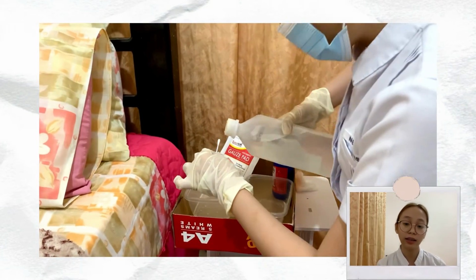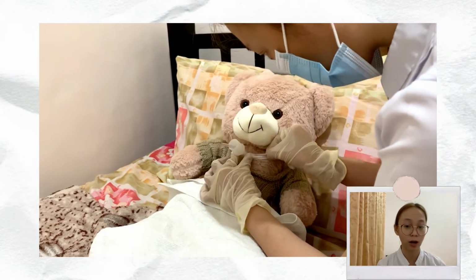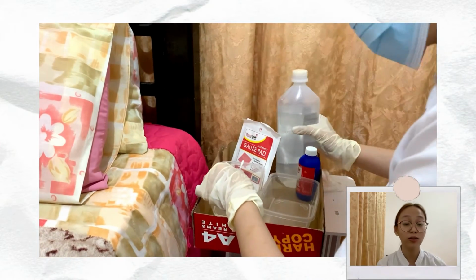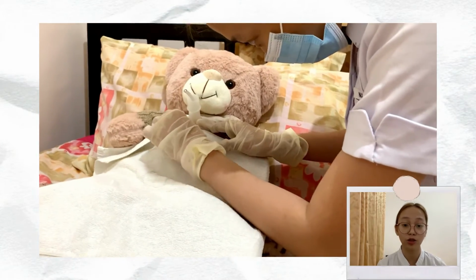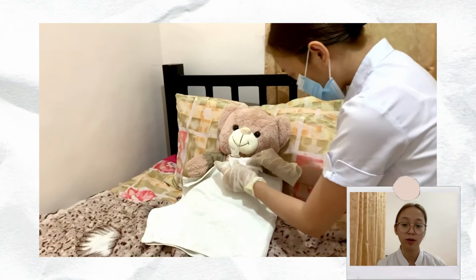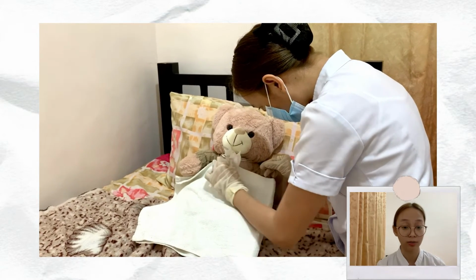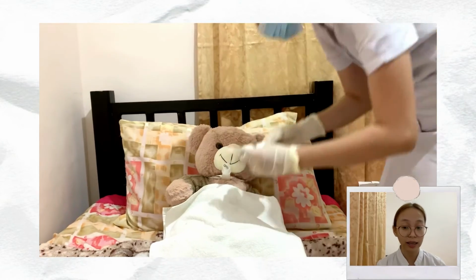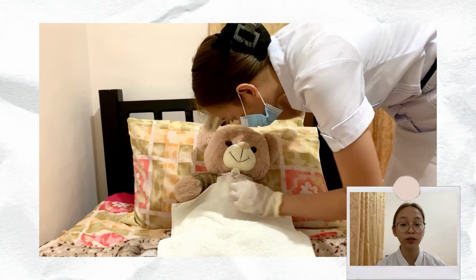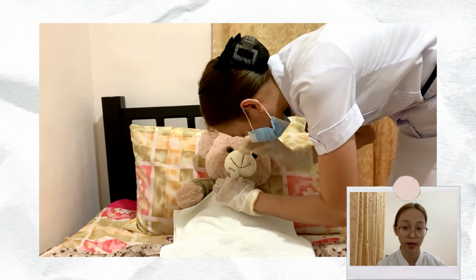Number 16, dip cotton tip applicator or gauze sponge in cup or basin with sterile saline and clean stoma under faceplate. Use each applicator or sponge only once, moving from stoma side outward. Number 17, pat skin gently with dry 4x4 gauze sponge. Number 18, slide commercially prepared tracheostomy dressing or pre-folded non-cotton filled 4x4 inch dressing under the faceplate.